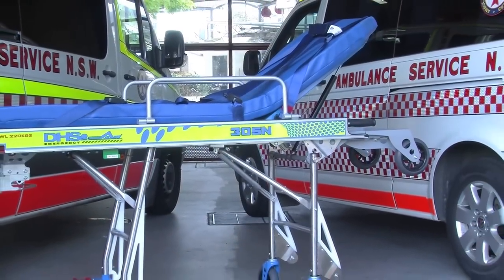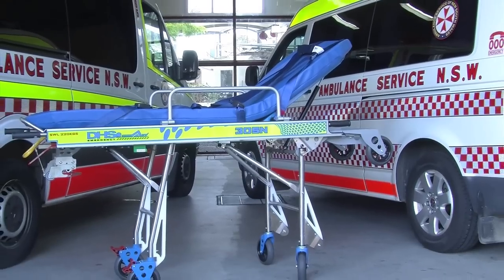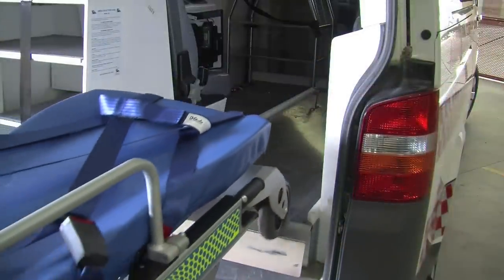If the stretcher does not load smoothly, there may be an issue worth discussing with your local workshop manager. But remember, loading wheel clearance helps in a successful load.